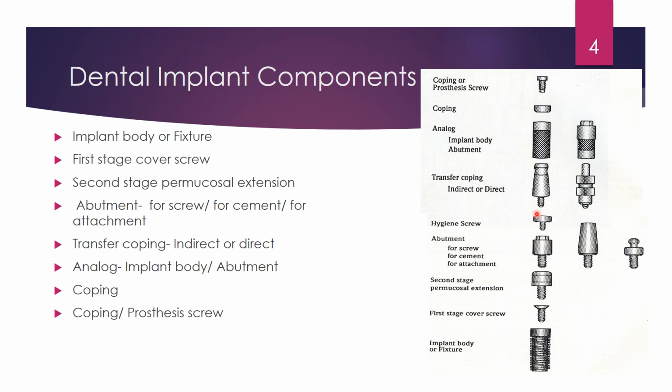Coming to a transfer coping. Transfer copings are precisely machined. Okay, sorry. This is the transfer coping. This is the indirect and this is the direct. Transfer copings are precisely machined from titanium alloys and attached to the implant fixture by a titanium screw or a guide pin. It helps us in taking impressions. So you fix it in the implant fixture with the help of a screw. Basically we take impressions by these. We'll be learning the open and the closed technique later.